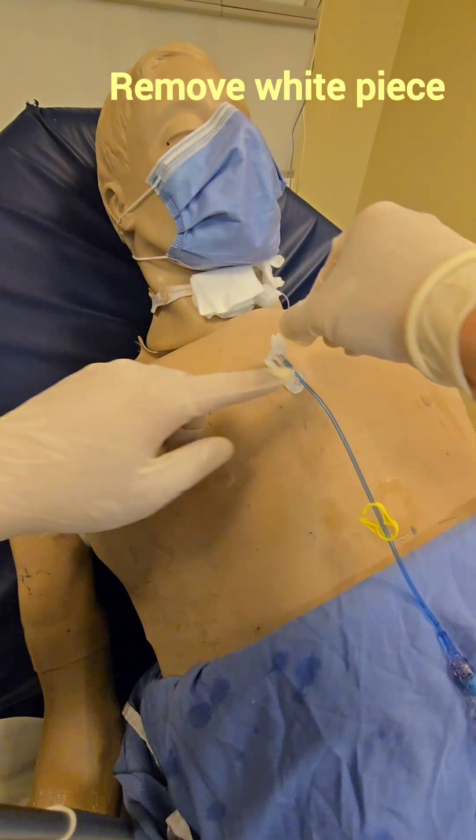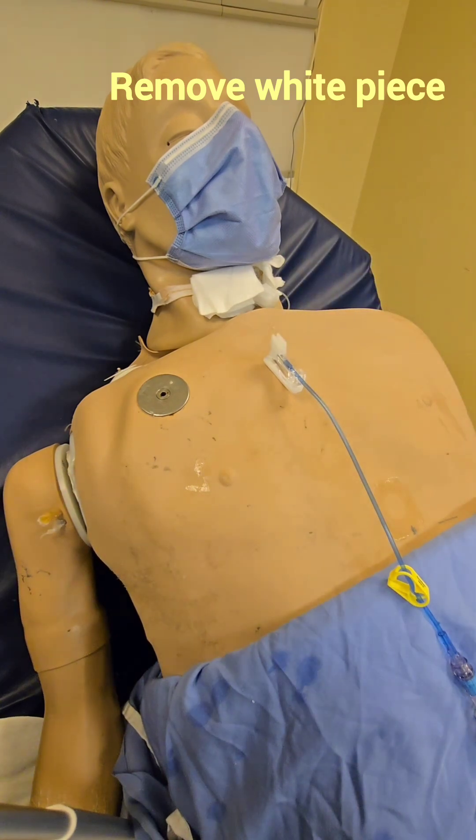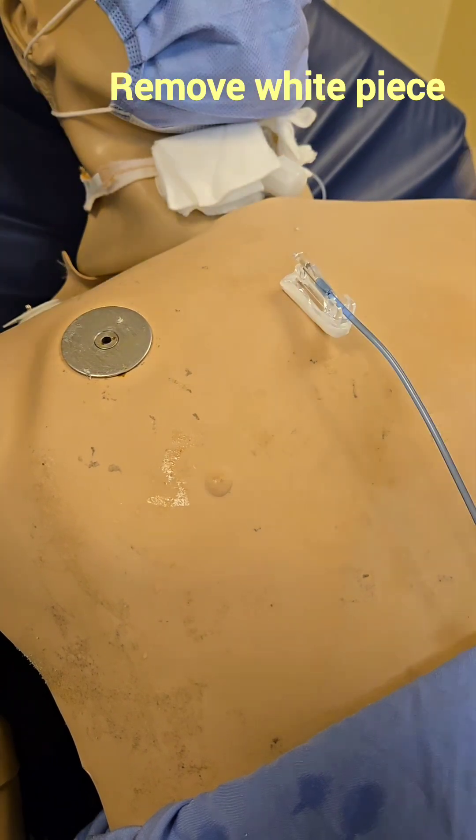Once we have flushed, this top part of the needle can be removed. The way you remove it is just pinch here and it comes up like that.